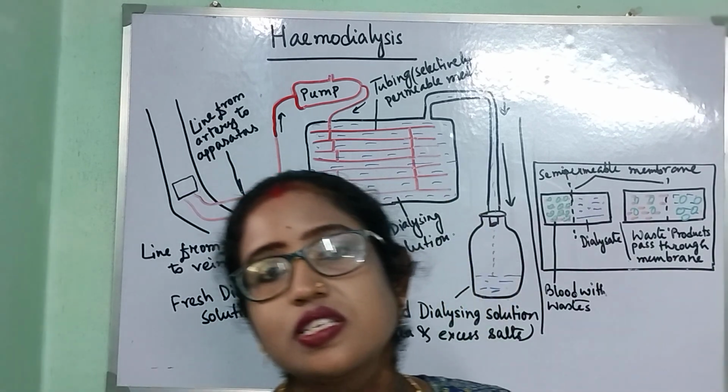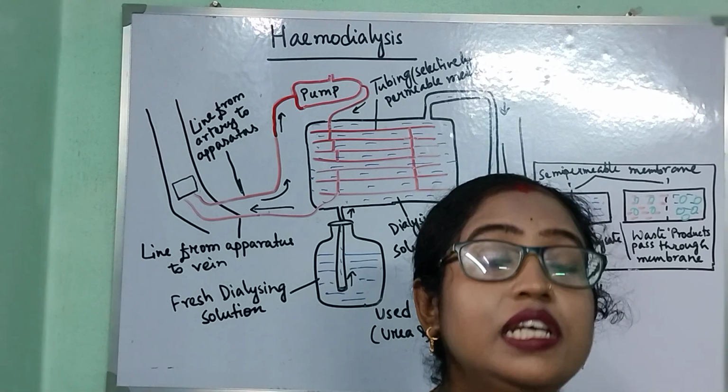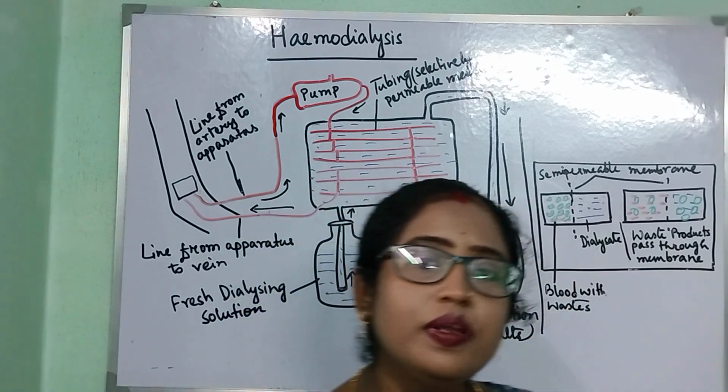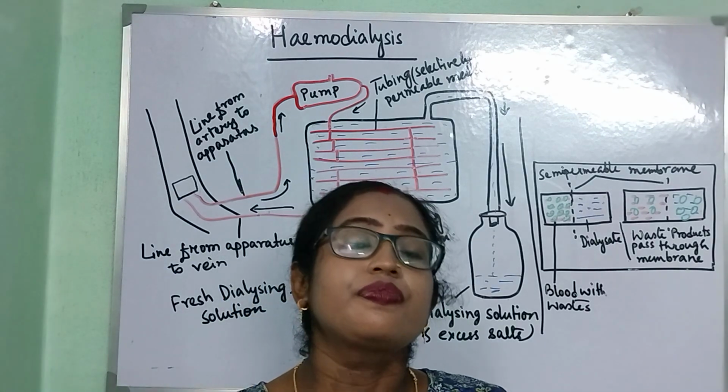Next question is, why does a human need an artificial kidney? In a normal condition, there is no need for an artificial kidney.